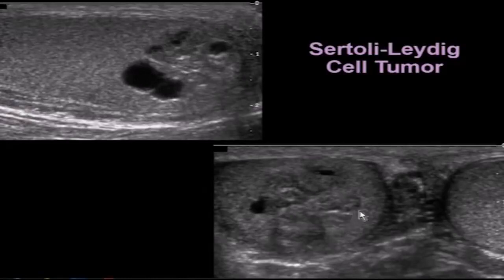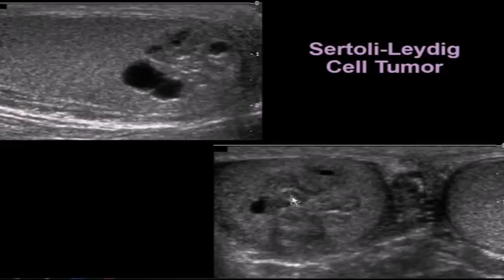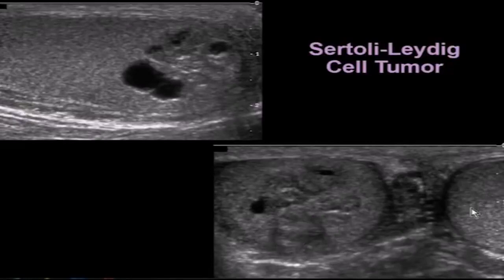On transverse view, we can see it has a lobular contour with a few cystic areas, and we can see how heterogeneous the mass is compared to the normal parenchyma of the left side and of the upper pole on the right side.